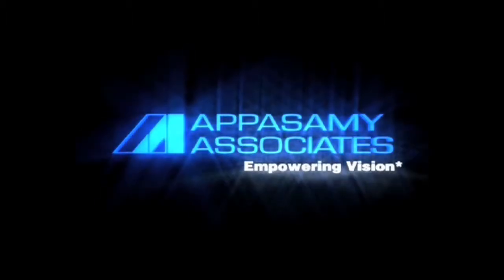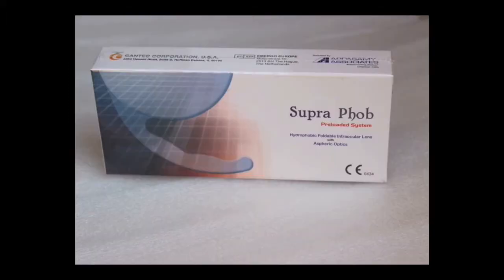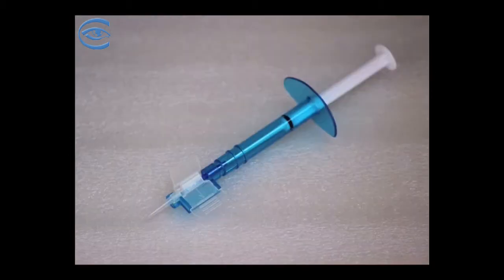This animation graphics depicts clearly the handling of the preloaded injector system prior to the implantation of the hydrophobic acrylic supraphobe foldable intraocular lens. The preloaded injector system with supraphobe lens is taken out from its sterile blister.